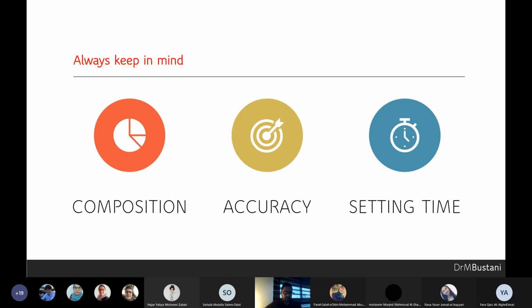I think that's it. Just a tip for you later on, always keep in mind the composition of the impression material, how accurate the material is and how accurate you need the cast to be. So for a primary impression, I don't need it to be as accurate as when I take an impression for a crown prep, for example.